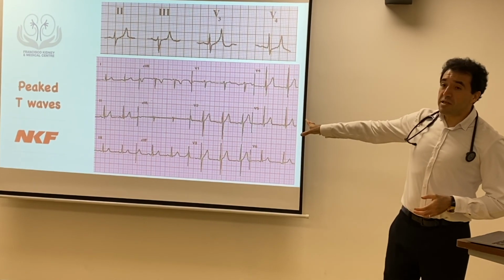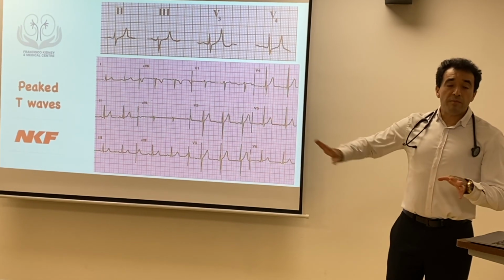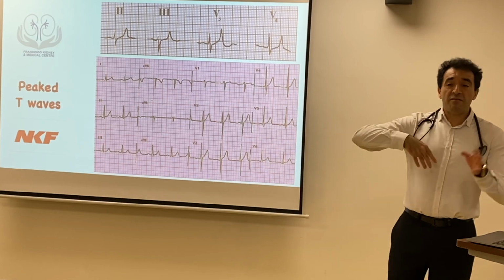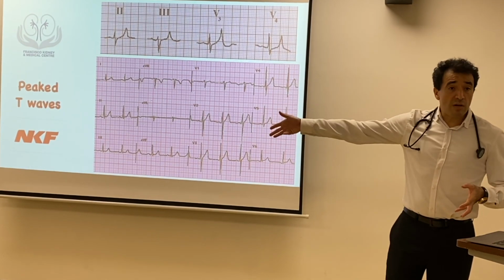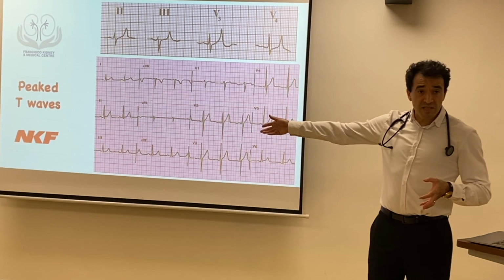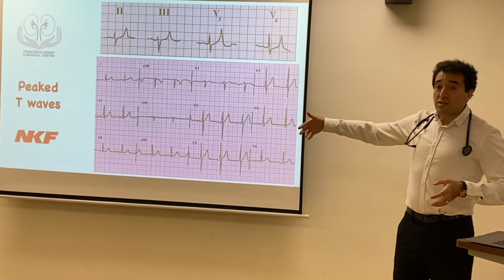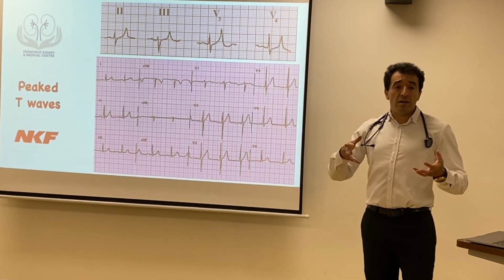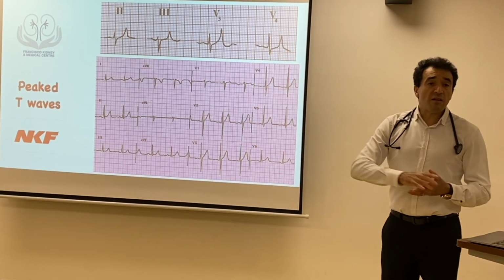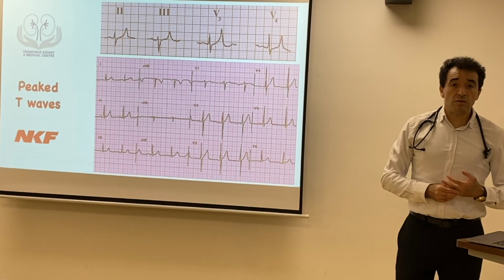Many of these patients, the ECG is one snapshot, just a few seconds. The next step probably would be to refer to a cardiologist and see what the doctor thinks, but then the Holter is also one of the next best steps, for 24 hours, or could be 48 hours. The Holter, an echo, and then maybe all together, and then eventually electrophysiological studies, and then you can decide what is best for the patient.